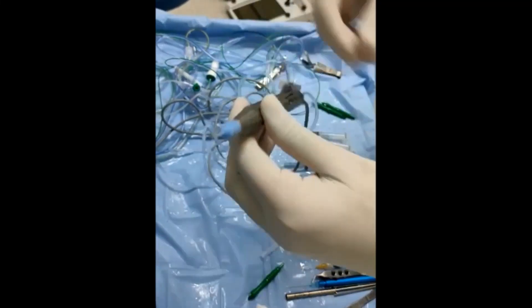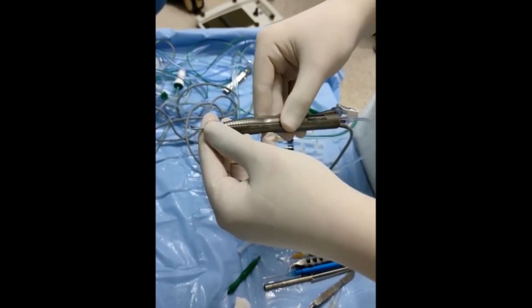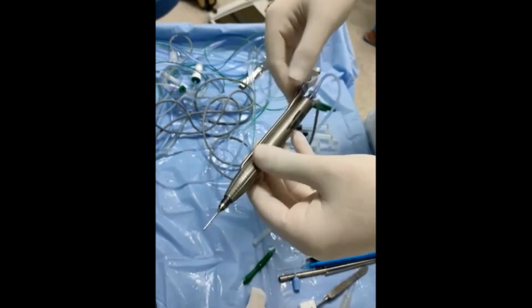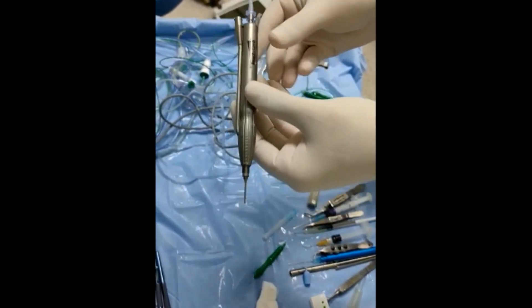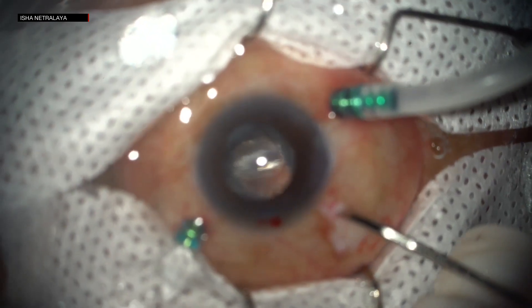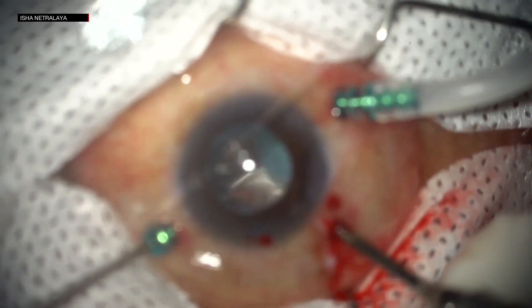Now, the same phaco handpiece was used by removing the sleeve of the tip and disconnecting the irrigating line. One of the sclerotomies was enlarged with an MVR knife for the passage of the phaco tip. The nucleus was emulsified in the vitreous cavity with the phaco tip.